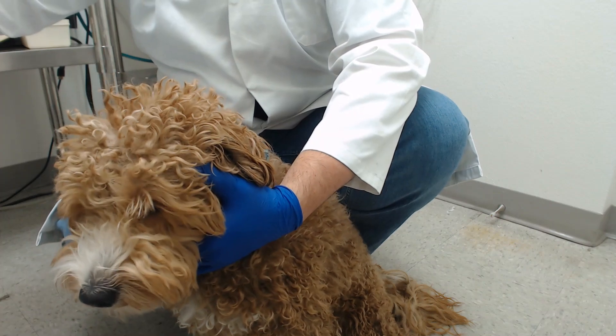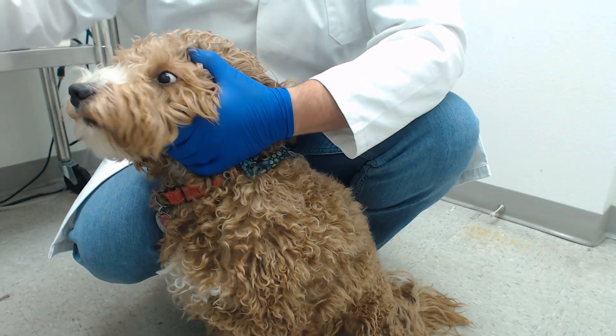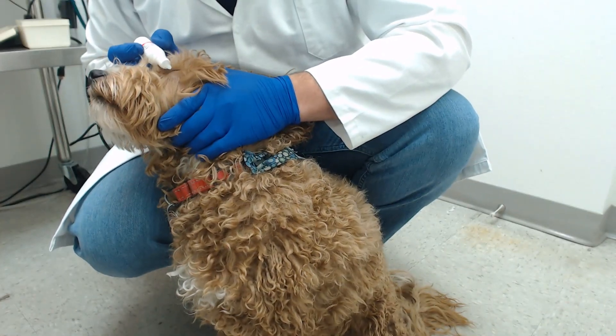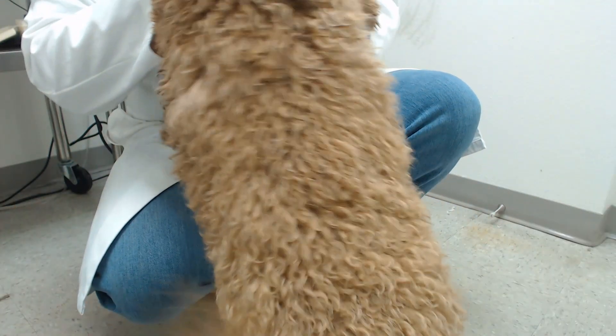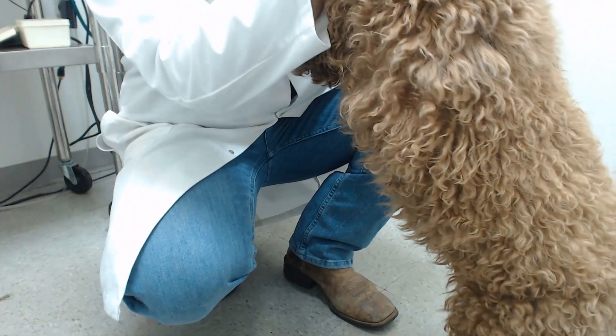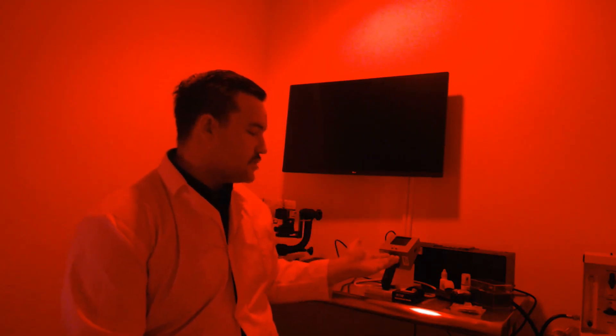Before getting started with the machine setup, we will apply the Proparacaine and Tropicamide to the dog's eye to allow it to start working. Something to keep in mind is that you will want to dark adapt the dog for at least 20 minutes prior to performing the test. To do this we will turn off the lights in our lab room and use an overhead red lamp. We will also be using our red LED headlamp for up-close viewing. After the drops are applied we will set a timer for 15 minutes and step out of the room, taking the ERG machine with us so we can set it up in normal lighting conditions.